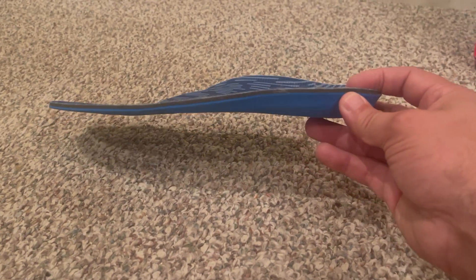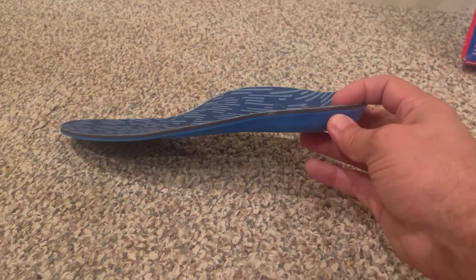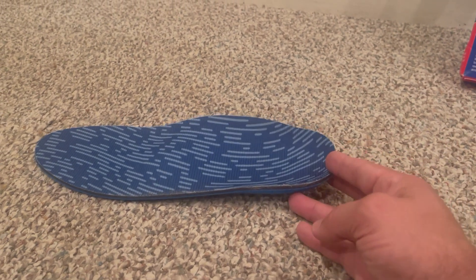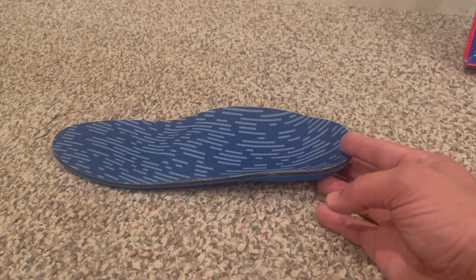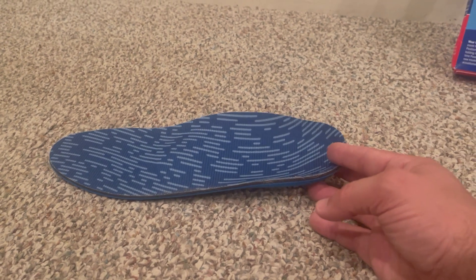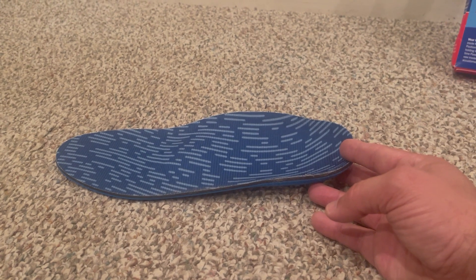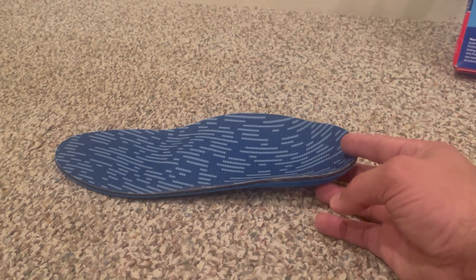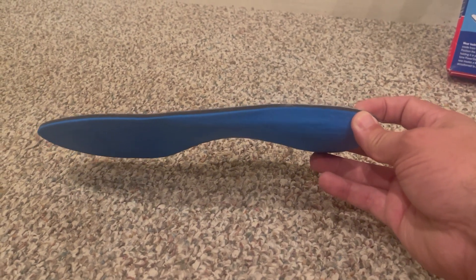Hey, this is Darren. I just wanted to give this quick review of a product I've found really helpful for plantar fasciitis. I've had plantar fasciitis for about two months — it's really painful. I've tried different insoles, and this is by far the best one I've found. A buddy recommended it to me, said it really helped him, so I gave it a try and I'm really loving it so far.